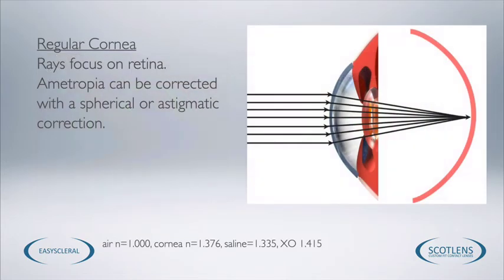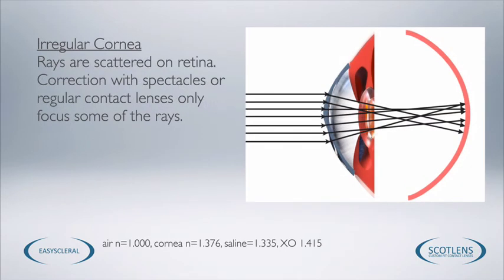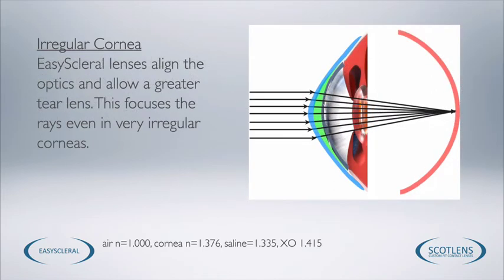The optical principles behind scleral lenses: if we have a regular eye, the rays of light focus onto the retina, sometimes without a contact lens or spectacle lens, and sometimes with. With irregular corneas, we get scattering of these rays of light. When we place a scleral lens on the eye, the lens has to center reasonably well because it's fitting over such a large area, and the tear lens regularizes some of the rays of light as they go through, so we should end up with a reasonably good focal cone of light and a clear image for the patient.